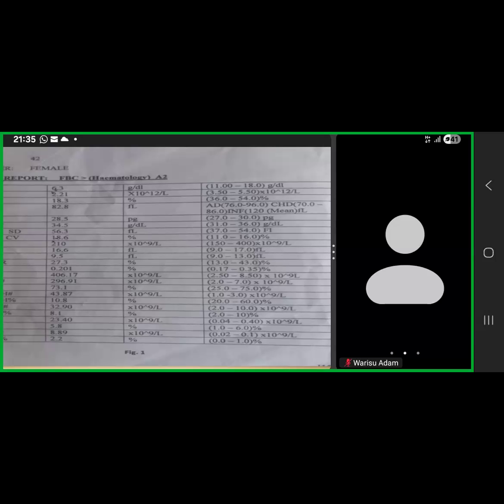And then if you can outsource the genetics, you don't have it and you outsource it. But most of the time, the film and the bone marrow are sufficient for making some of these diagnoses because they are easy to make.